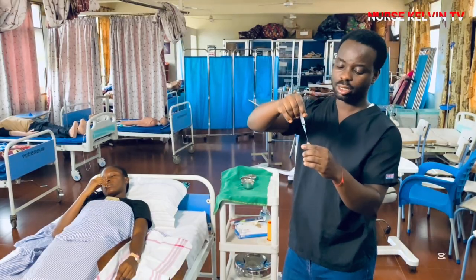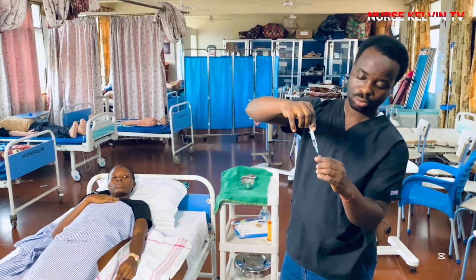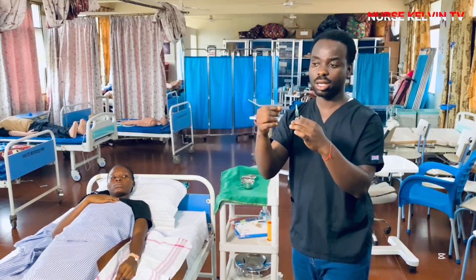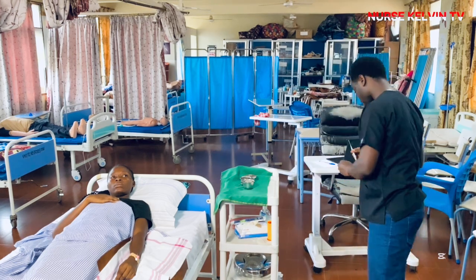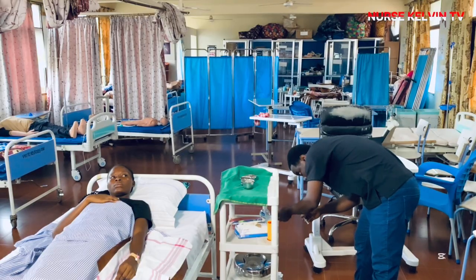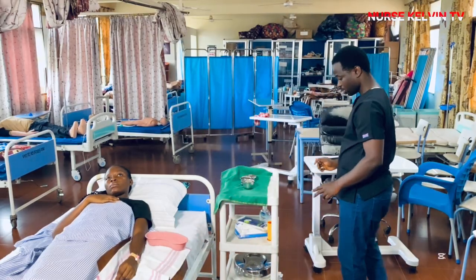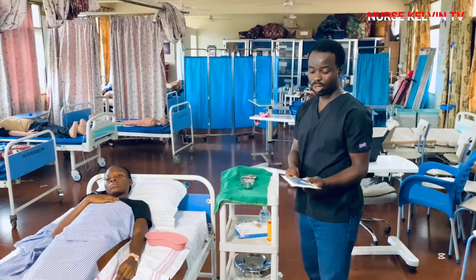Then you withdraw the medication. So guys, I'm coming to wear the sterile gloves.